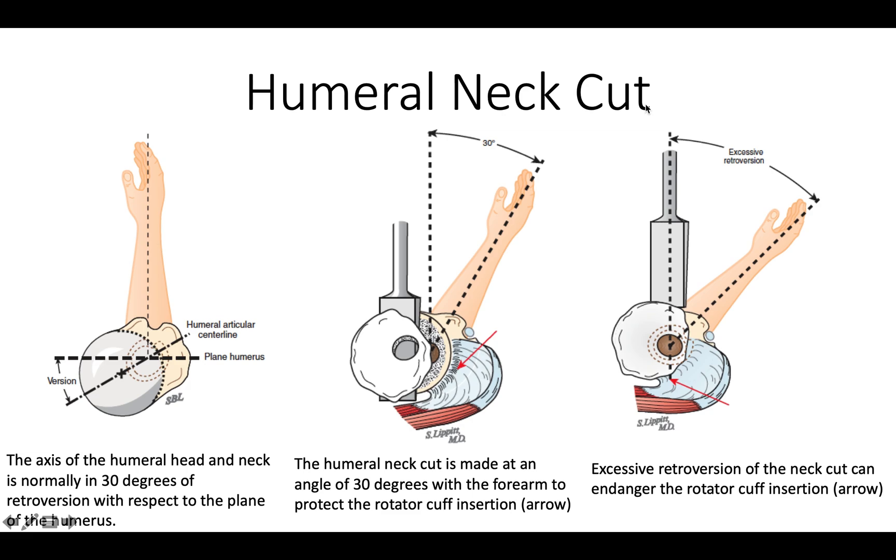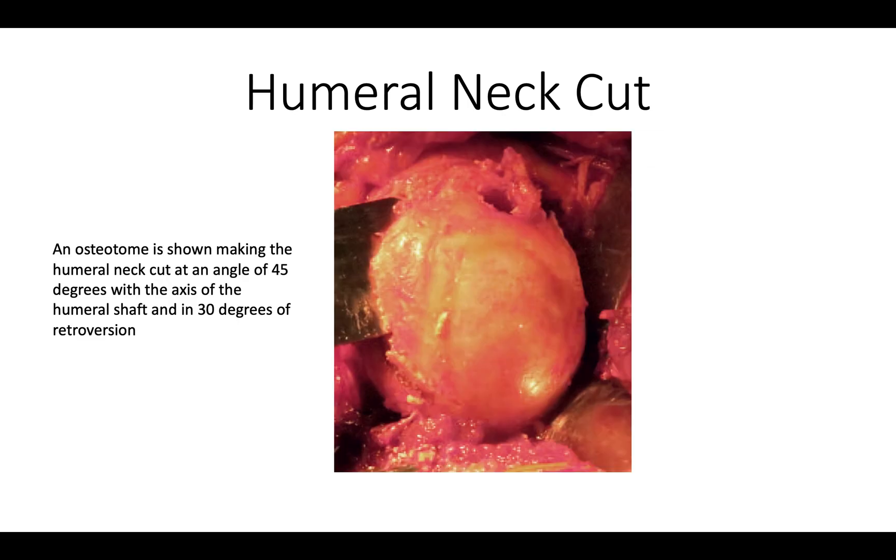When making our humeral neck cut, we want to make sure we make the cut at 30 degrees of external rotation so that our rotator cuff is protected. If the cut is made with the humerus in too much external rotation, the rotator cuff will be endangered. Here's an example of a properly done head cut where we're protecting the soft tissues around and very carefully advancing the blade across the humerus.